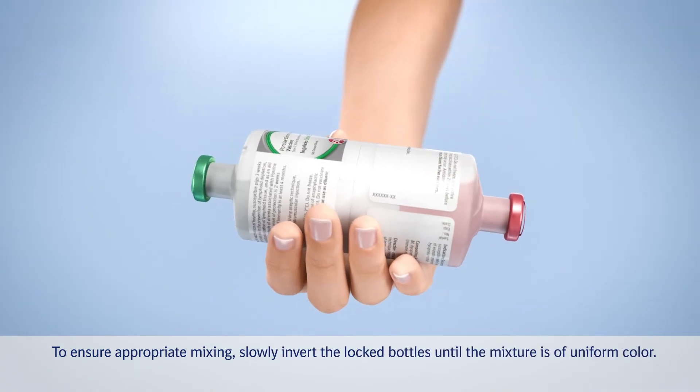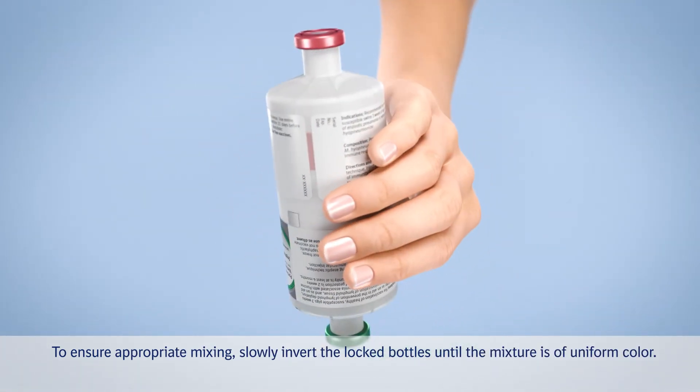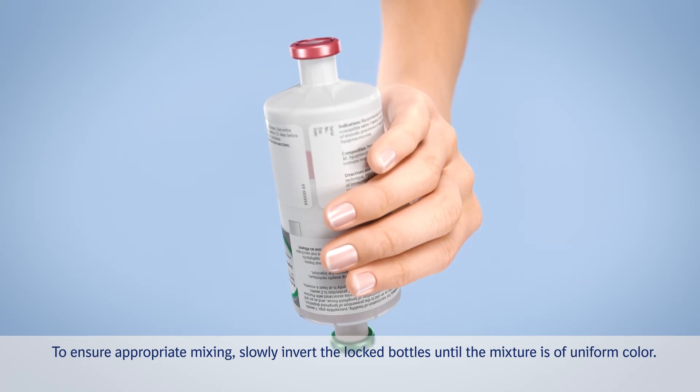To ensure appropriate mixing, slowly invert the locked bottles until the mixture is of uniform color.